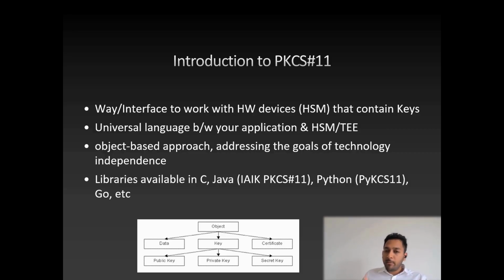The libraries are available in common programming languages like C, Java, Python. So you can implement that in your programming language, and you can just issue a set of PKCS11 commands. And the manufacturer must have implemented PKCS11 libraries that convert those commands into the device-specific commands, codes.